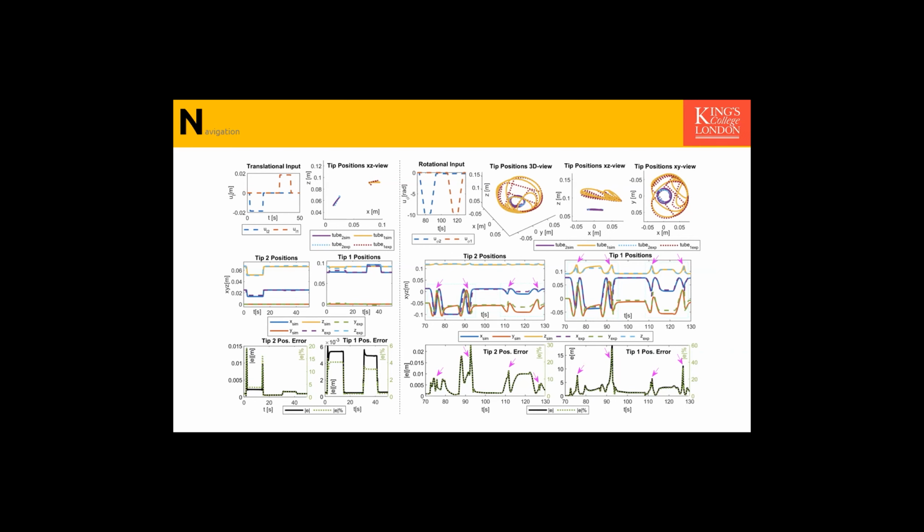Okay, and this more generalized model, does that result from your choice of kinematic representation or from your choice of how you do the time integration? To be honest, I don't know. I solve an ODE. Caleb solves a boundary value problem optimization method. So I have a Lagrangian here. He has a Newton, basically a Cosserat rod dynamic there. So a lot of things may be in play.